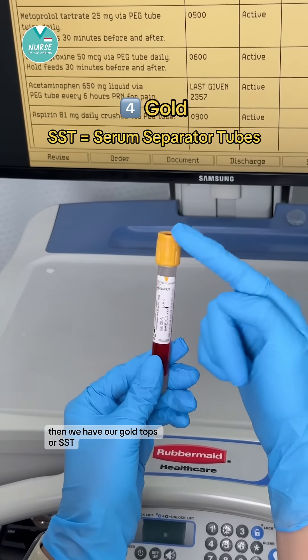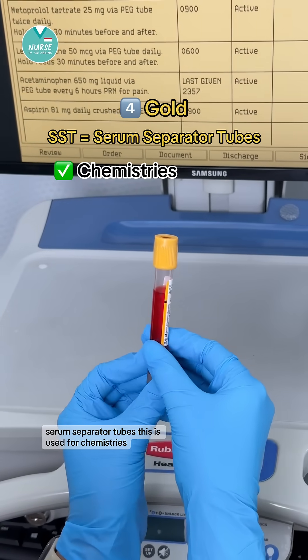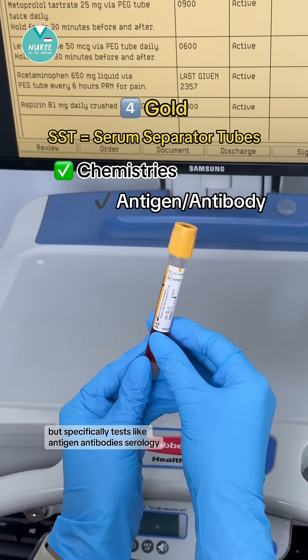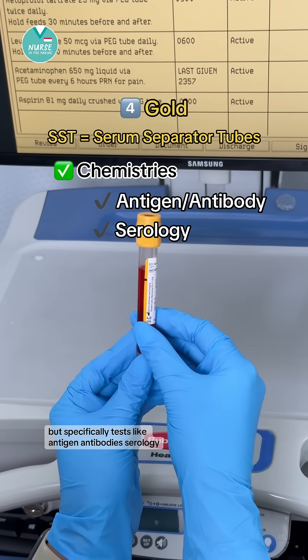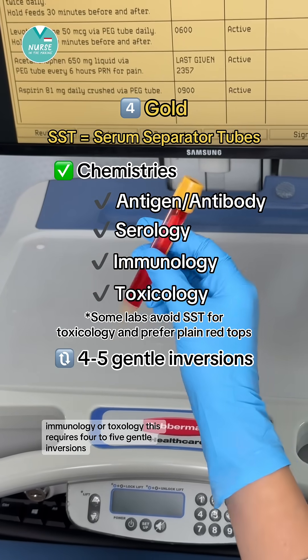Then we have our gold tops, or SST — serum separator tubes. This is used for chemistries, but specifically tests like antigen antibodies, serology, immunology, or toxicology. This requires four to five gentle inversions.